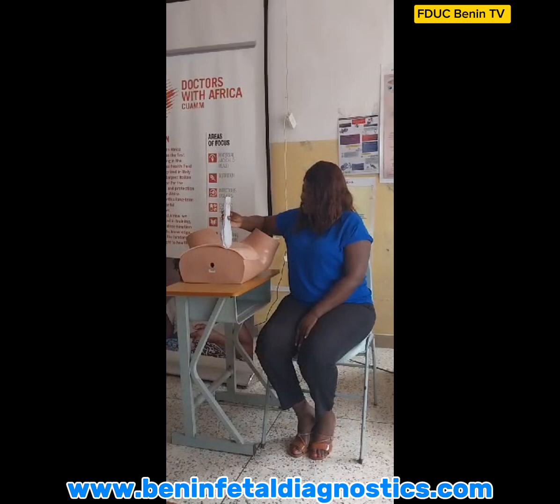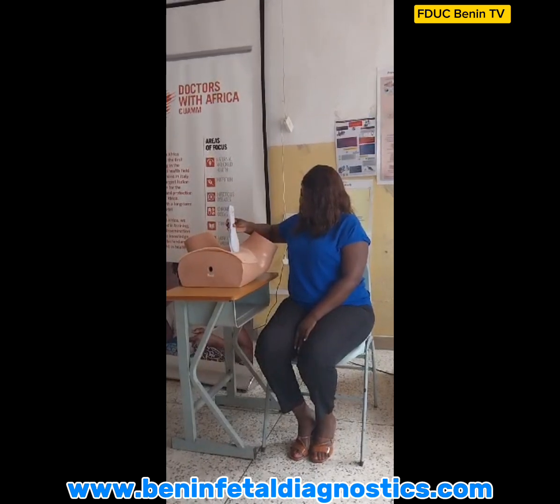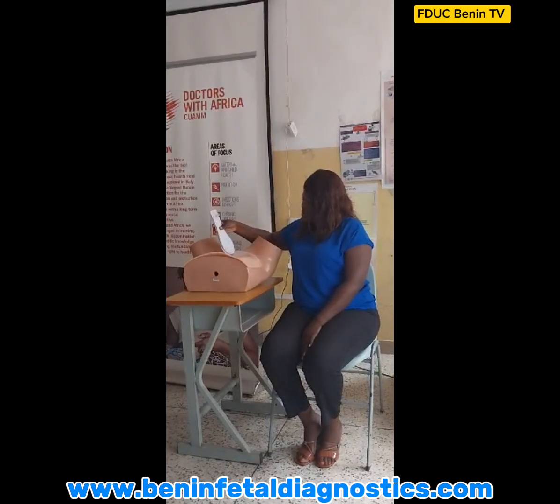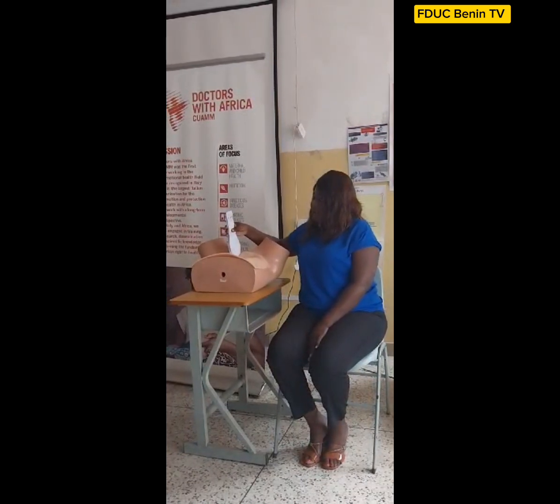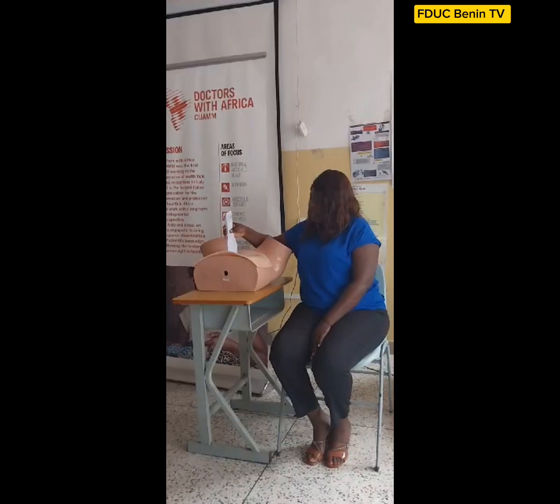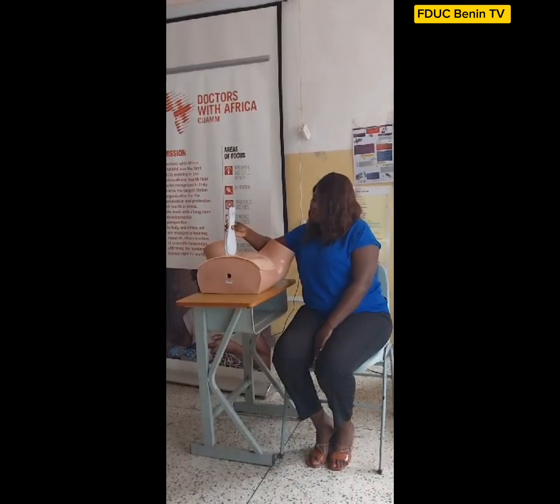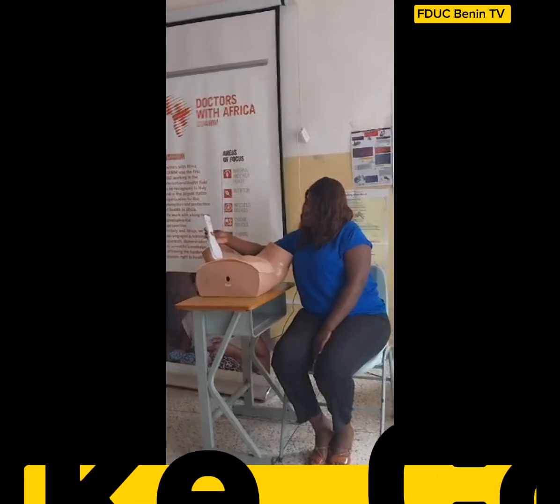Then I'll slide again on the narrow axis towards the maternal pelvis. When I get here, I'll slide again on the broad axis towards the midline. Then I'll slide on the narrow axis away from the orientation marker towards the fundus again, looking at structures. Then when I get to the fundus, I'll slide on the broad axis to the maternal left.